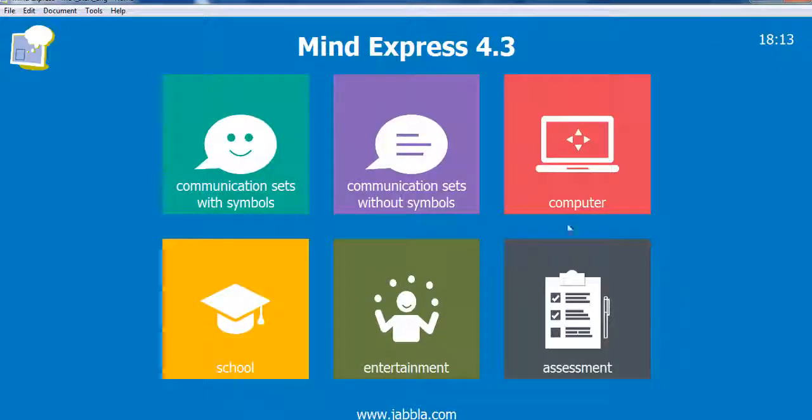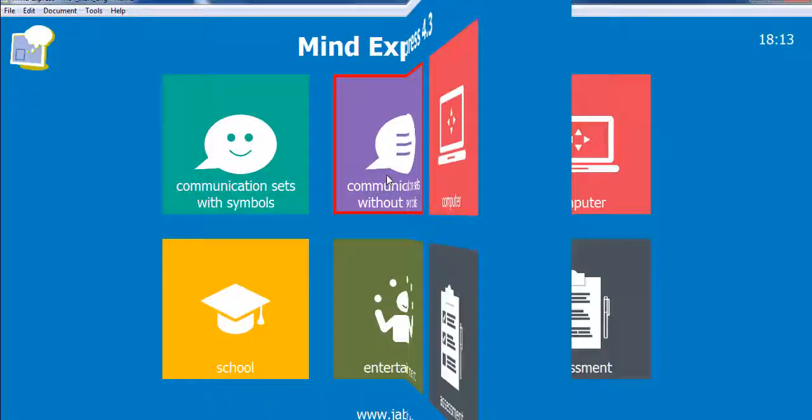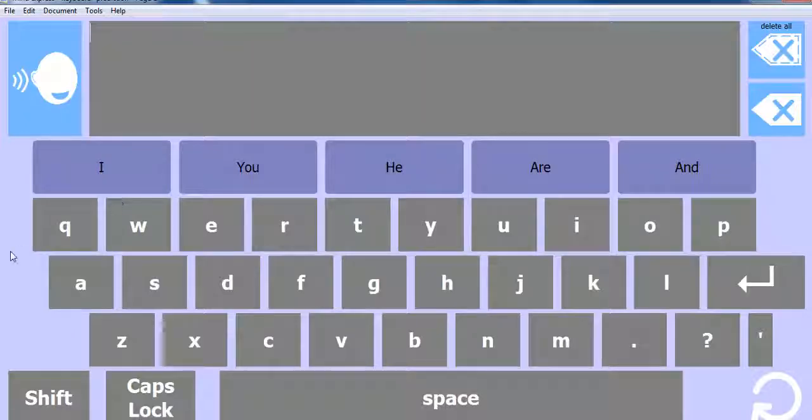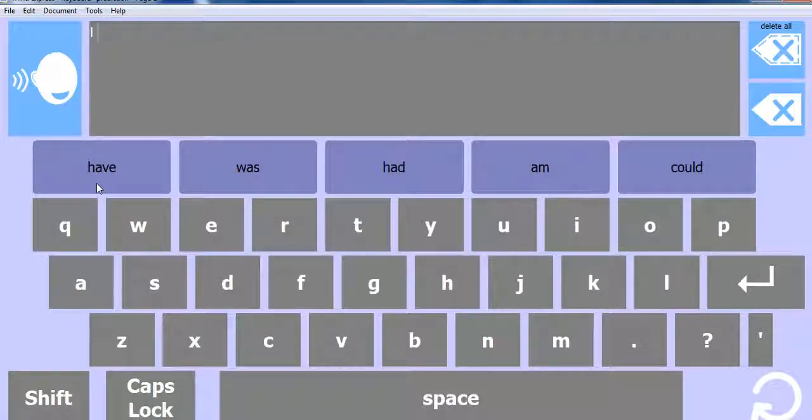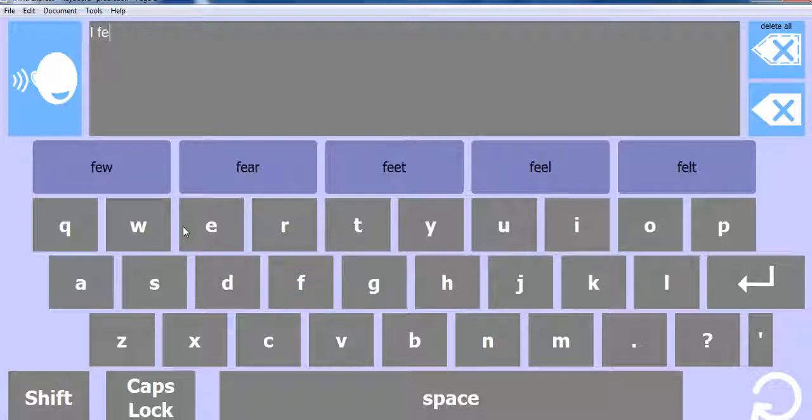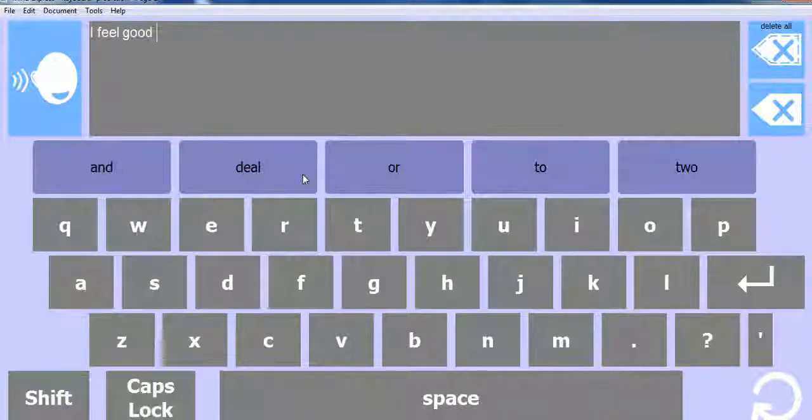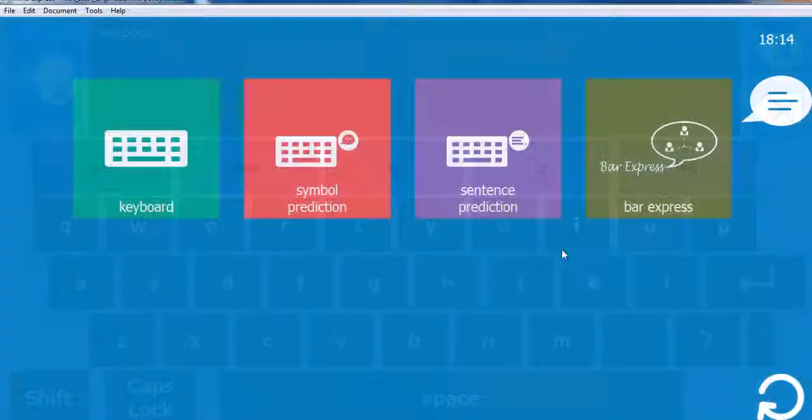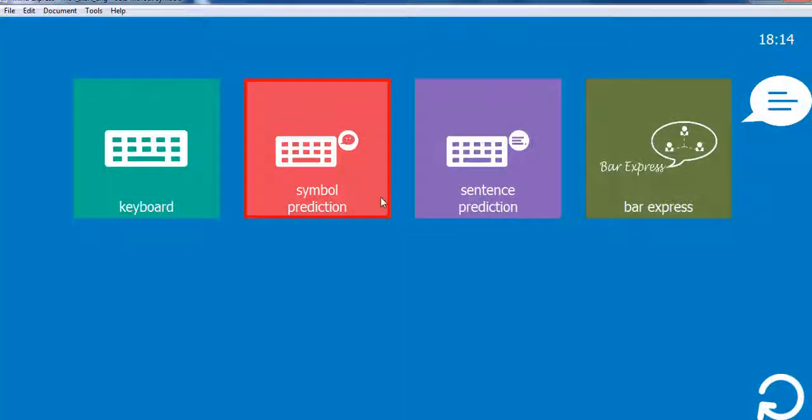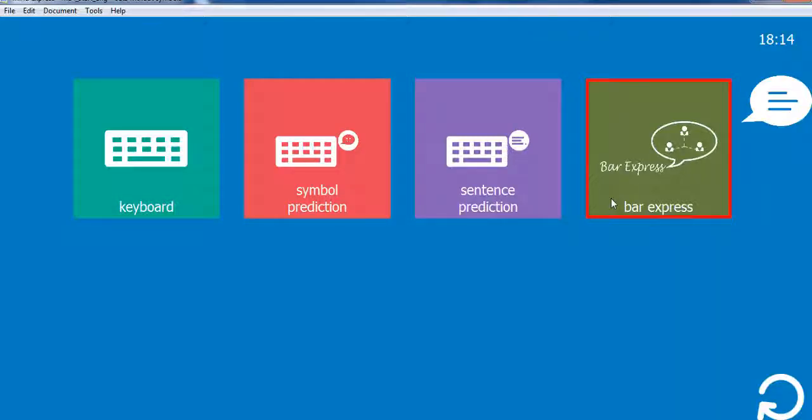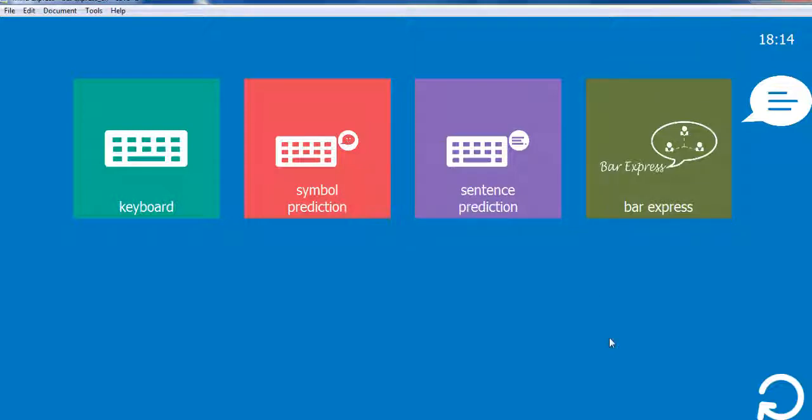The next group includes keyboards with word, symbol and sentence prediction. I feel good. And a complete text-based system for literate users with eye gaze support.